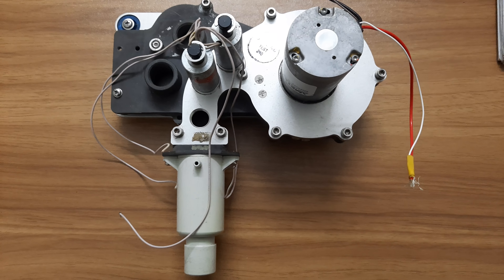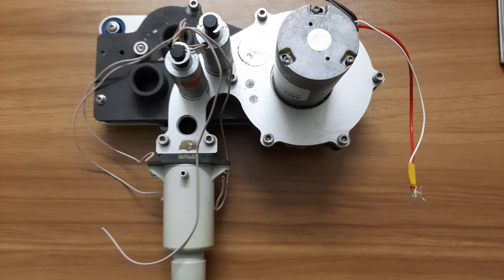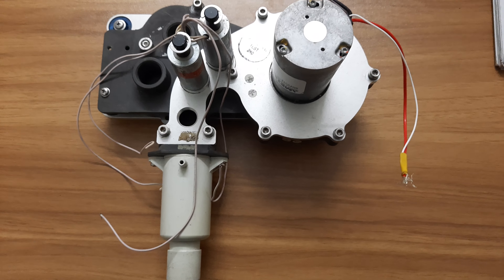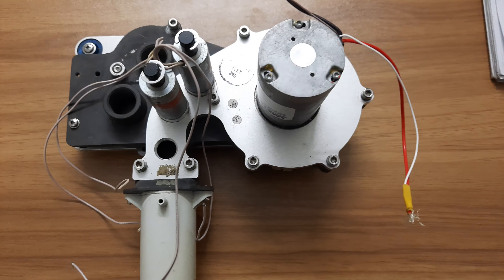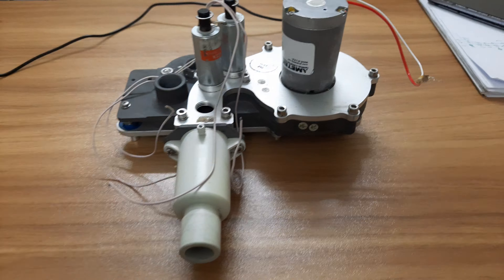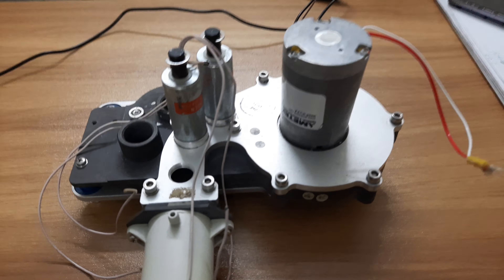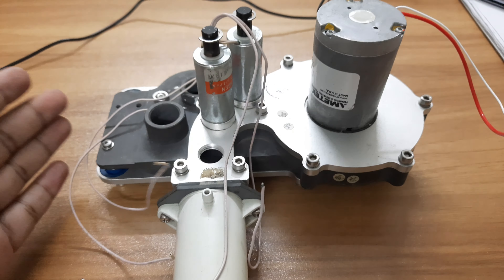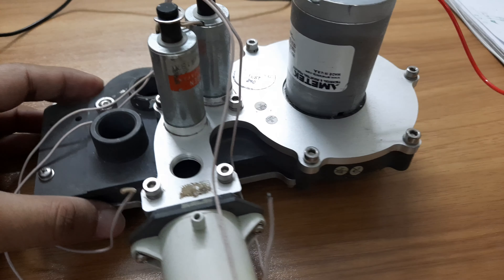Hello viewers, this is Nabil from Tech Mechanism. Today I am going to show you a turbine from a Versa ventilator, which is actually made by the company Jena Electric — a very flagship ventilator. This is actually a quick video; I already tore down this turbine from the ventilator and I think I should share it with you.